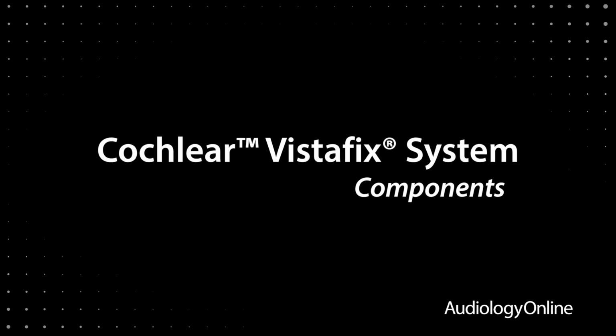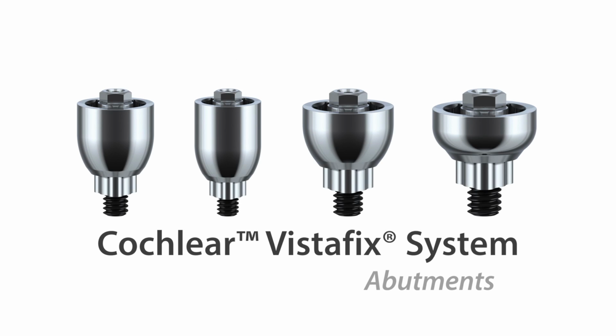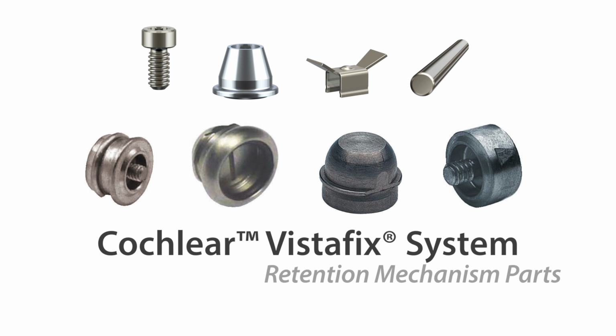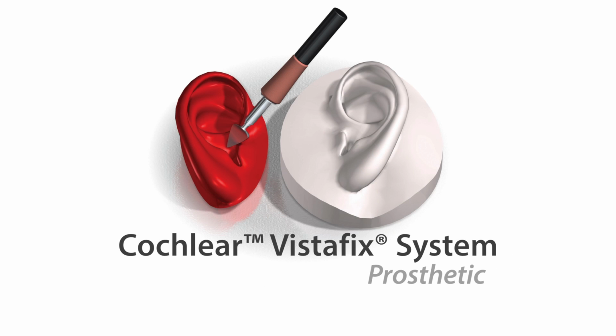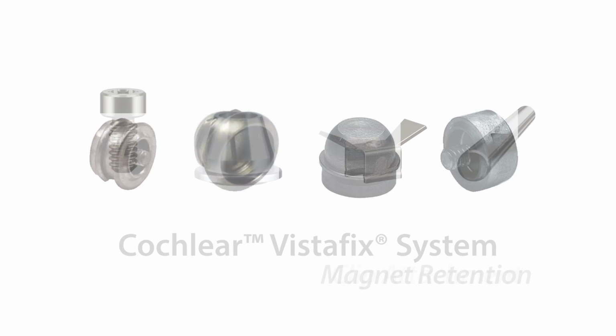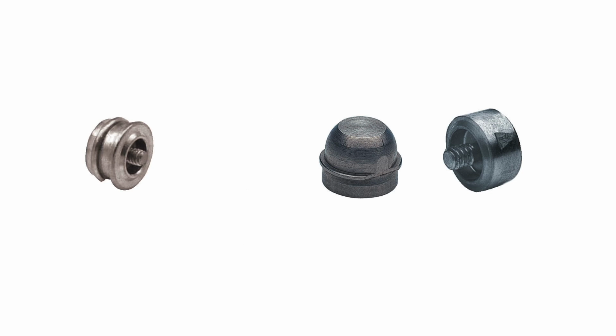The Vistafix system consists of three primary components, which include the osseointegrated implants, the abutments which connect to the implant, and then a retention mechanism for the prosthetic. Attached to these three components is the prosthetic that the anaplastologist makes. There's two types of retention mechanisms that are commonly used today, either a bar and clip, which is the more traditional mechanism, or a magnet retained prosthetic. Either option is commonly used, and they're both easy to attach with minimal effort on the part of the patient.